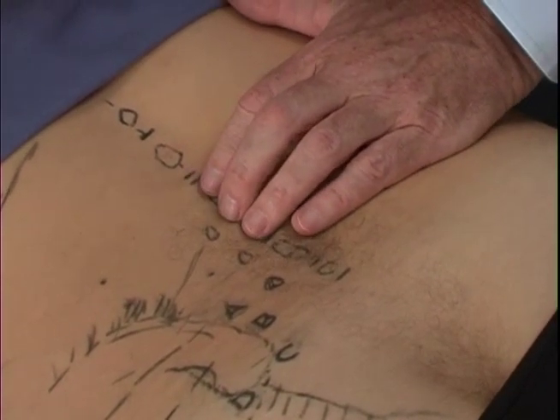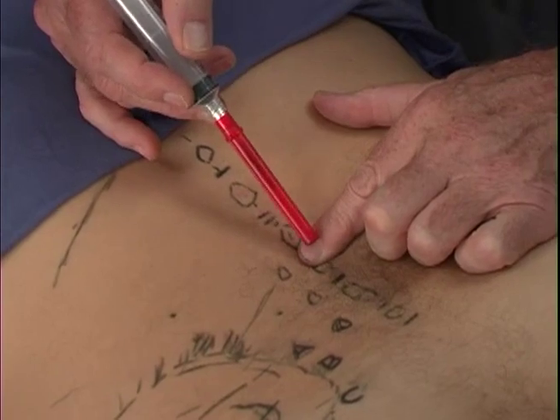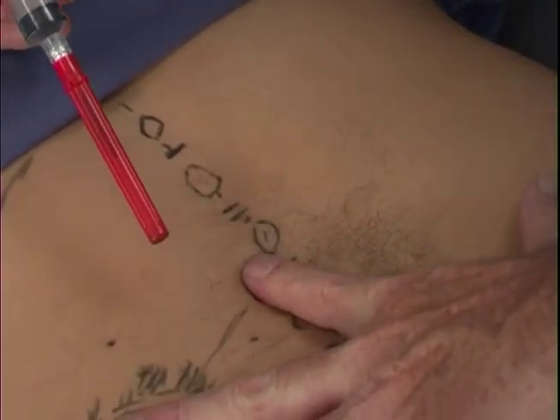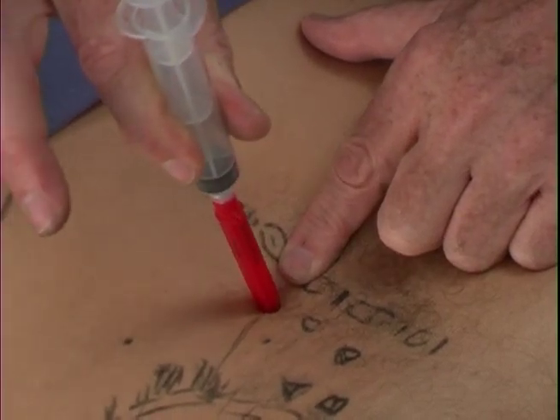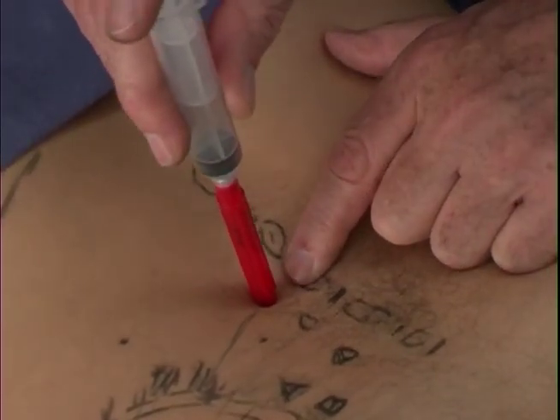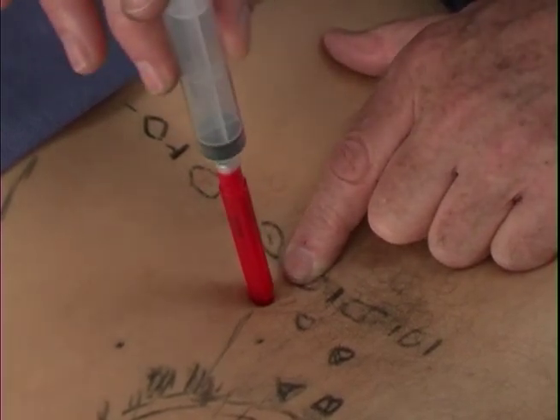Our next injections are carried out into the facets. And as we recall when we were marking our anatomy, if we feel the interspace, that area between the spinous processes, we can come down about a finger breadth off the spine and come either straight in or with a little medial angulation down until we hit that area of the interspace, realizing that we're not attempting to get into the facet itself, but we're attempting to inject the capsule, that ligamentous tissue that supports that facet and holds it together.